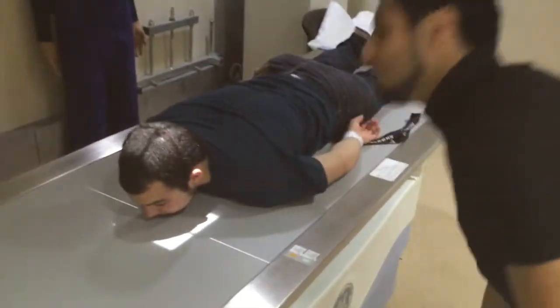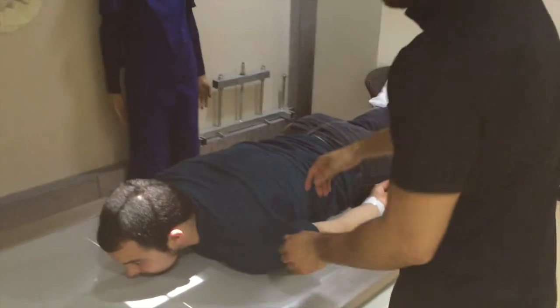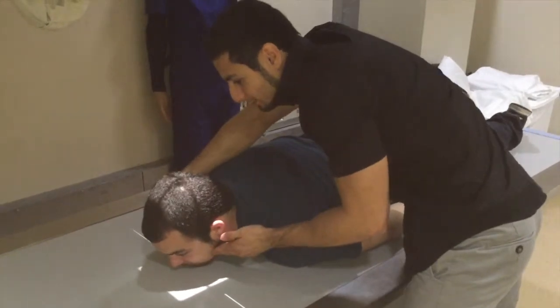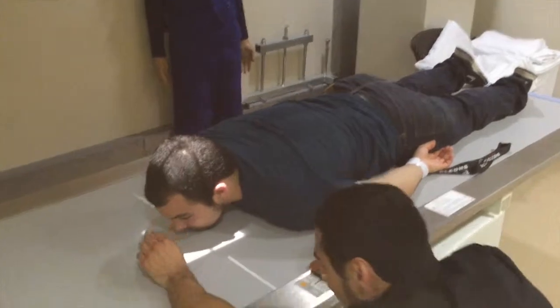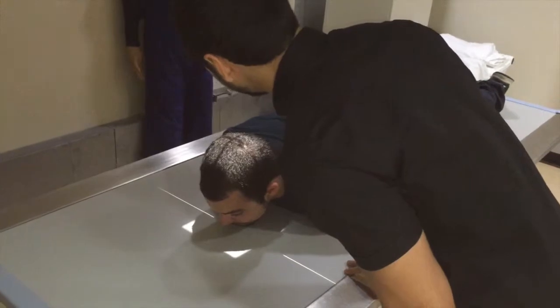Everything looks good here. So in order to make sure the MML is perpendicular to the tube, we want to look and feel for his mastoid processes. So I'm going to go ahead and just make sure he's nice and straight. And we also want to look at the orbital margins, the orbital roofs, to make sure that no tilt is evident. Just a little. The patient may move, so we want to make sure his mid-sagittal plane is aligned center.